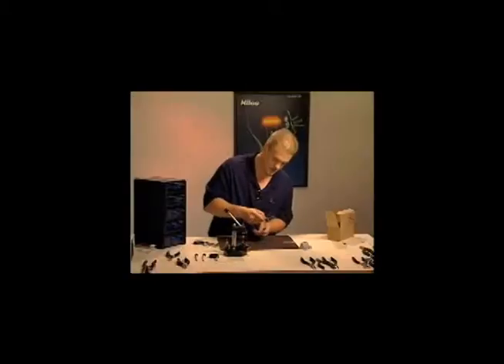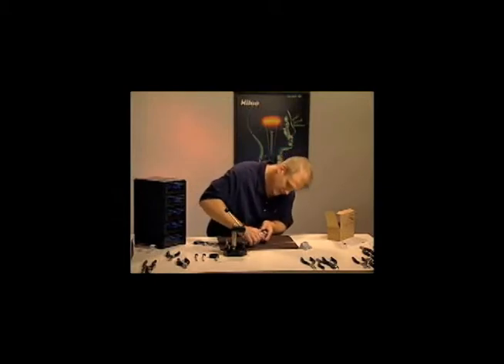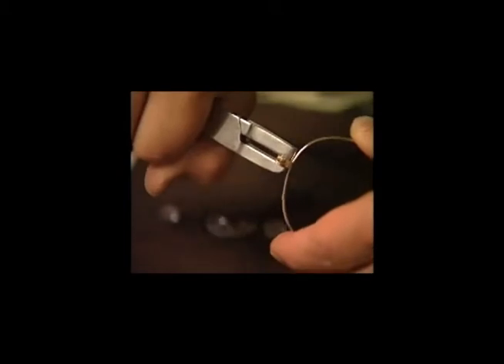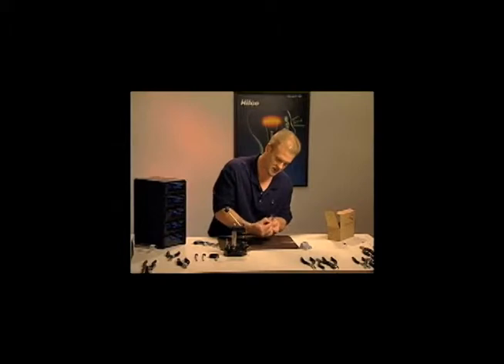Now we'll try it in the closing barrel as well. Once again, getting the punch as close to the center of the head of the screw as possible. Squeeze it. It punches it through the threaded portion of the closing barrel, and then we can just pull the rest of the screw out the remainder of the way.